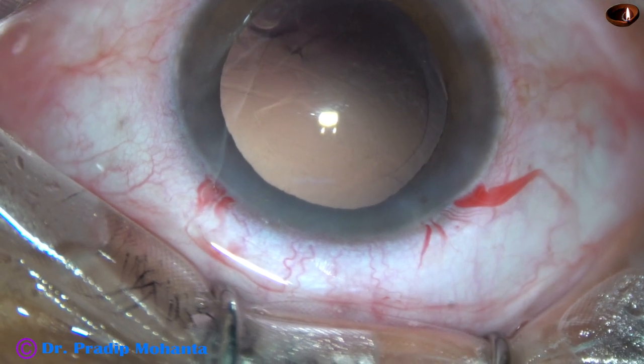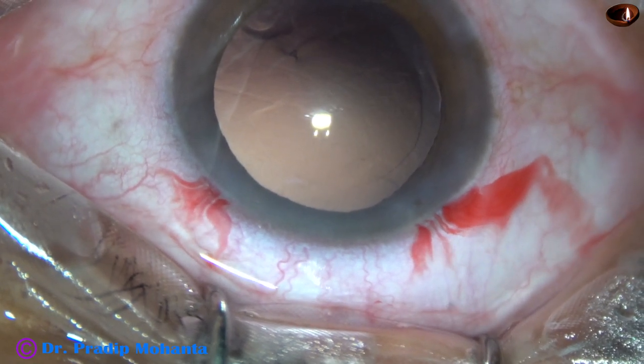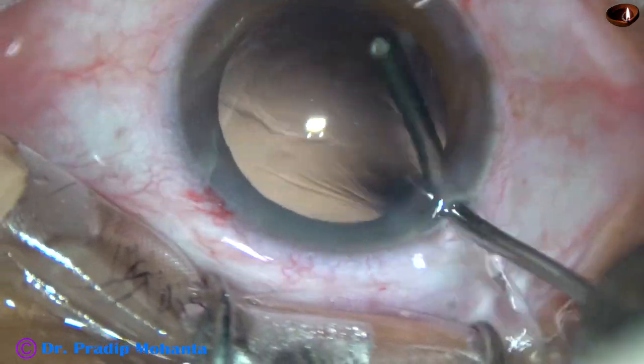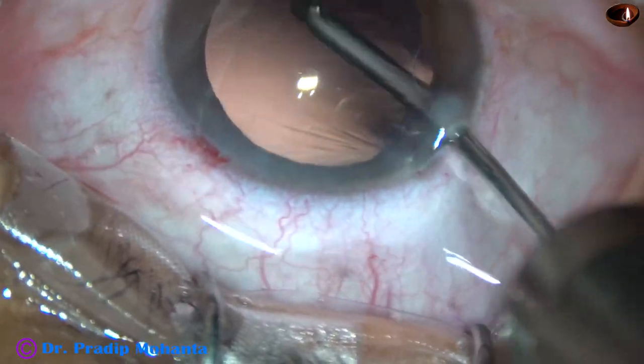There are some cells sticking to the posterior capsule. I have taken the irrigating probe only of the bimanual IA, and I am removing the cells just by the irrigating jet of fluid. This manoeuvre can be called hydro-polish.